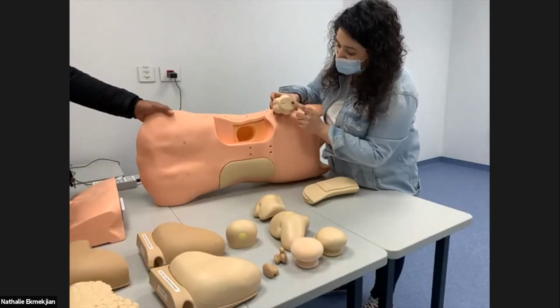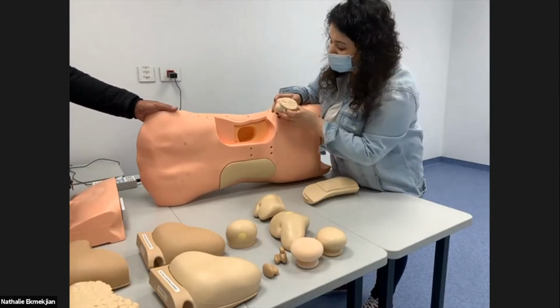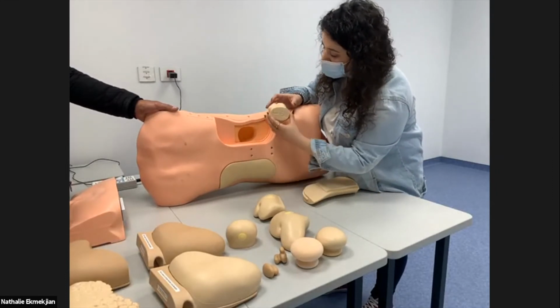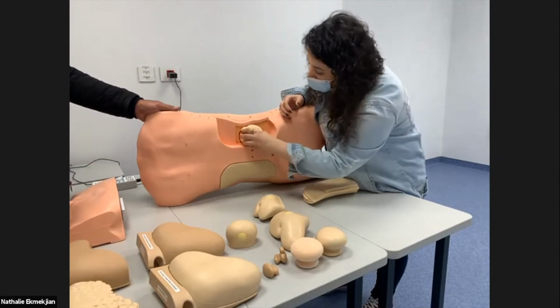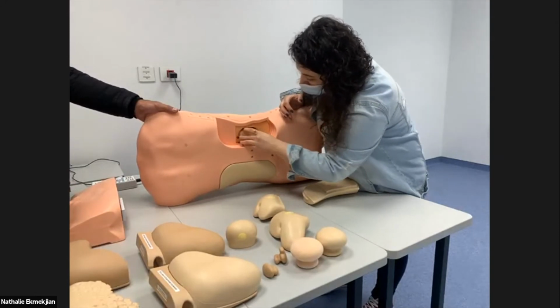So as you can see, the head, the arrow, we have it up. So this means that they tell us the position should be in this, okay? So we have the circle for the upper position, and we see the arrow and work accordingly.